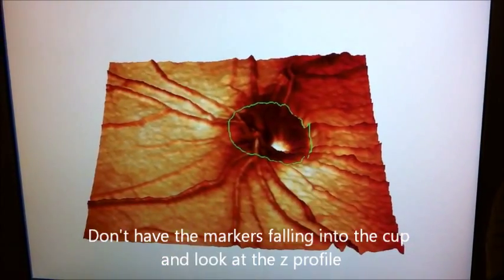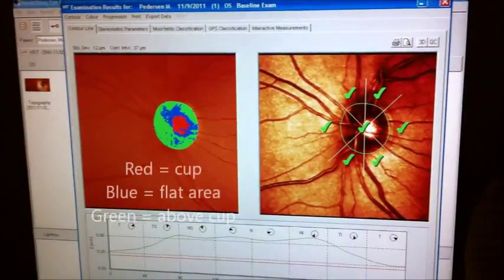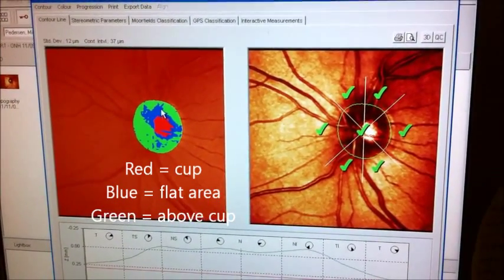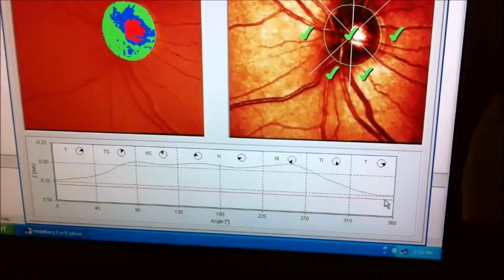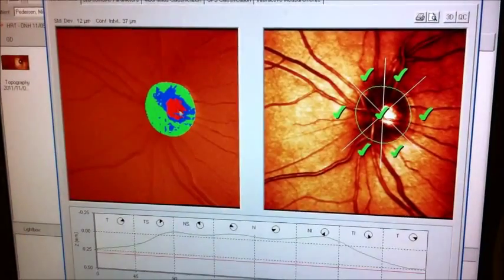You don't want to go too far out on the PPA zone. The color coding here — red is the cup, blue is the flat area, and green is above. You can see there's a little blue line right there; that's called your reference plane. What the software basically does is it takes a nerve, turns it on its side, puts a cross section on the reference plane, and creates a color-coded map.